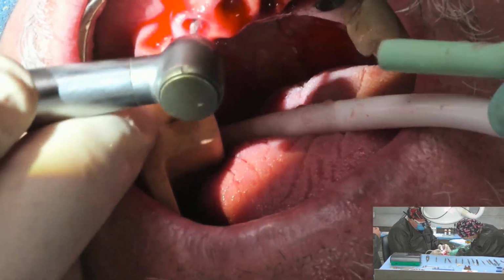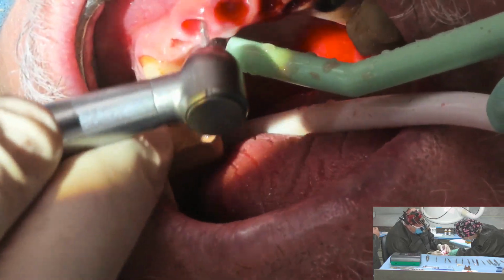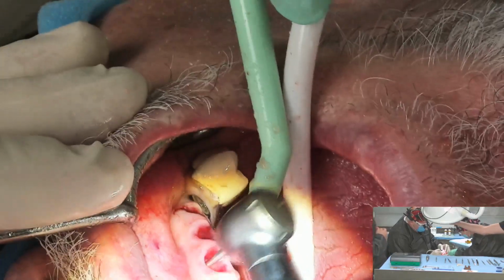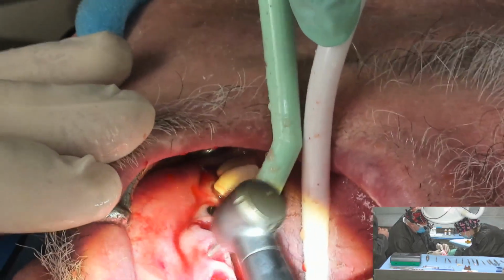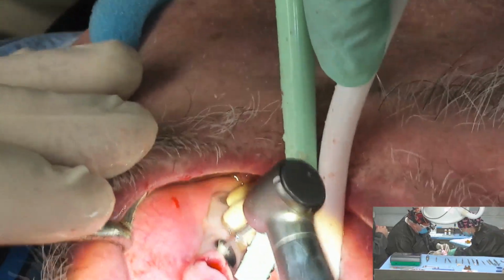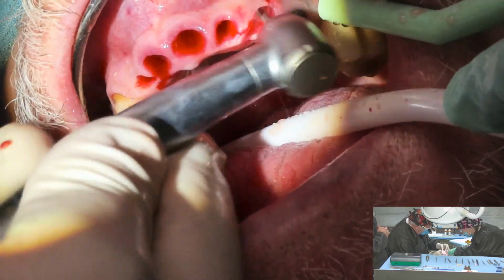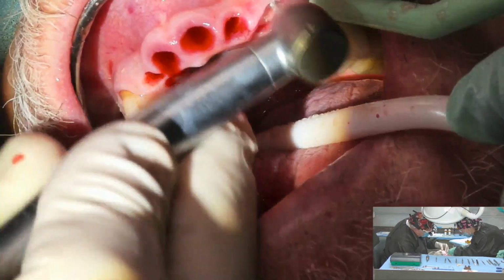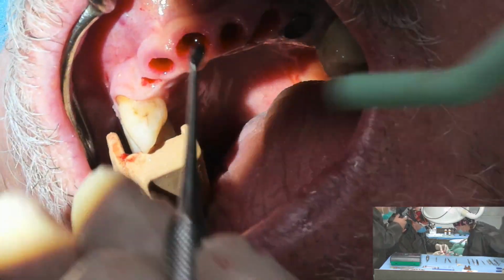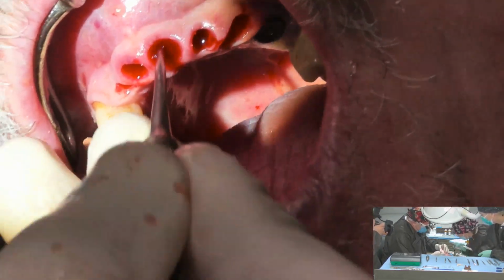And then the second phase of debridement, to make sure that we can proceed with immediate restoration, is going to be rotary instrumentation, debridement of the extraction socket. And I'm just removing all remnants, periodontal ligament, any granulation tissue, down to good basal bone. Okay, small molt. Then I'm also going to go in with the small molt and just ensure that all remnants are taken care of.